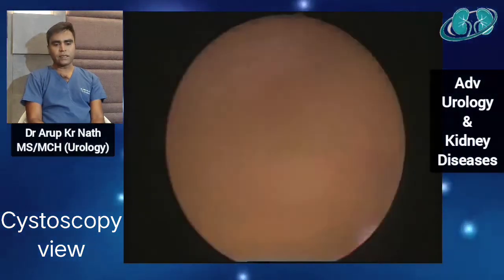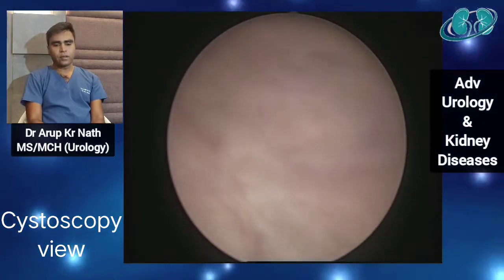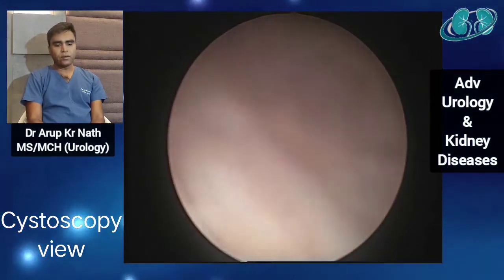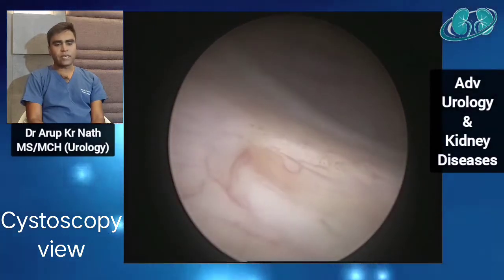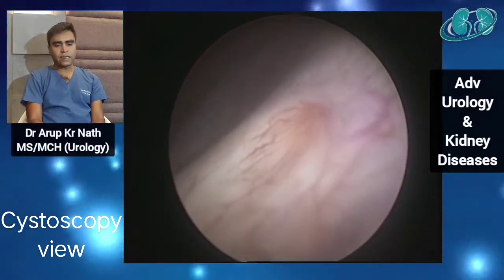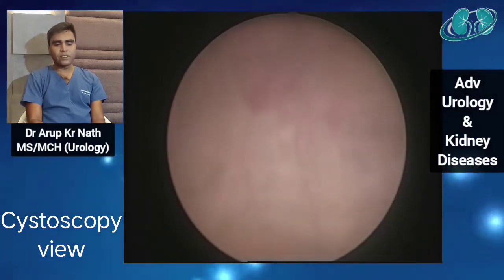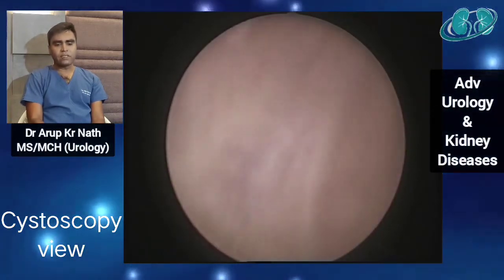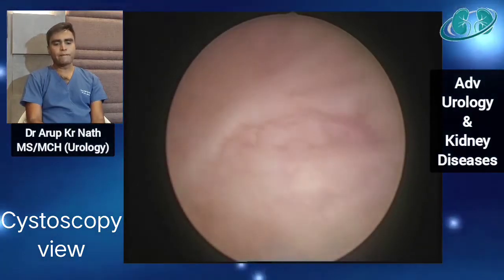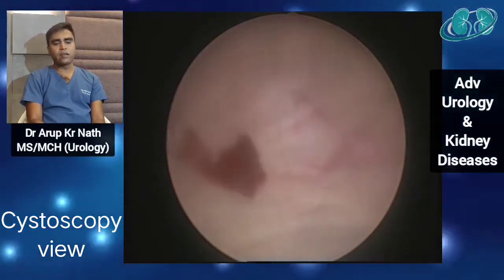This is the bladder neck and this is the interior of the bladder. A small clot is visible which is moving, and systematically we will see the ureteric orifices, the right and left, and then the bladder mucosa, whether there is any evidence of inflammation, bladder diverticula, trabeculation, or presence of any bladder tumor. If there is any stone inside the bladder, that is also very well visible.